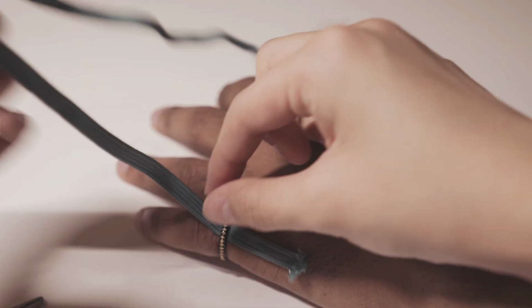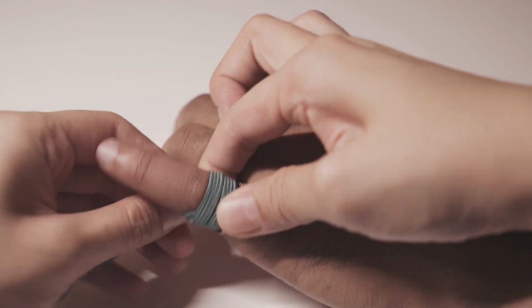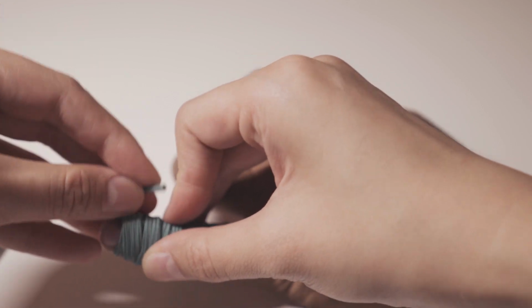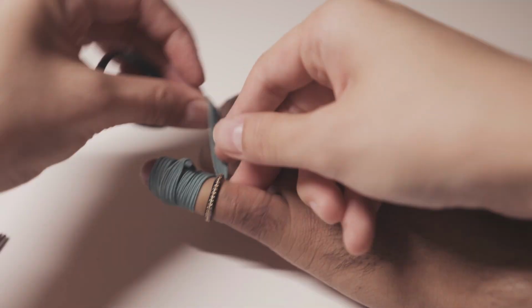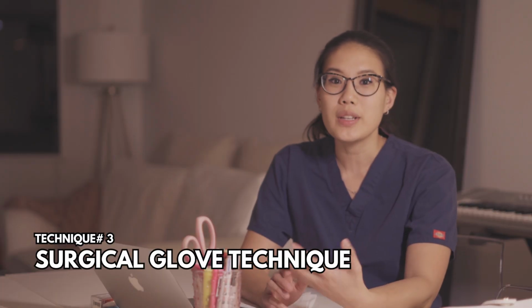As a reminder, this isn't the most comfortable procedure, so make sure your patient is properly anesthetized. Continue wrapping the material until the end of the digit and make sure there's no tissue visible between the strings. When you're done wrapping, start pulling the proximal end of the string in a circular manner until the ring is removed. The idea here is to wrap the finger tight enough to bring down the swelling so the ring can come off.